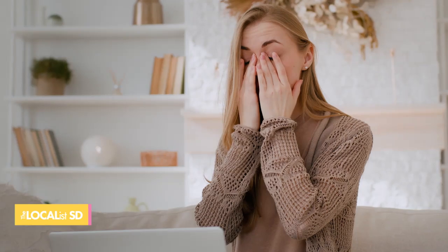Somebody comes to you, finds out they're a good candidate for EVO ICL. What is the process? What's the recovery time? Well, the first aspect is who is a good candidate for the EVO ICL. People who are nearsighted have about 3 diopters all the way up to 20, where they'd be seeing about this close to their face, with astigmatism up to about 4 diopters. So it treats a very wide range of prescriptions.